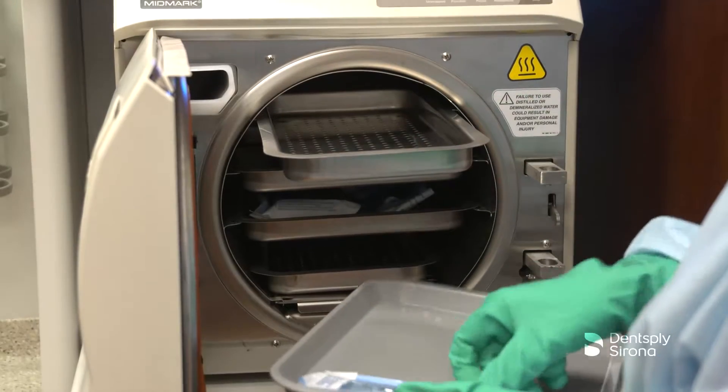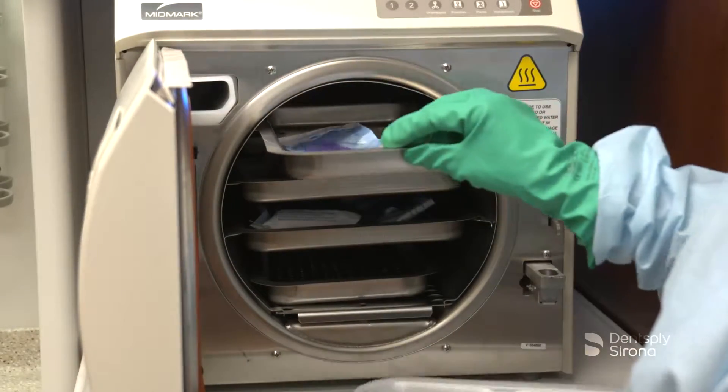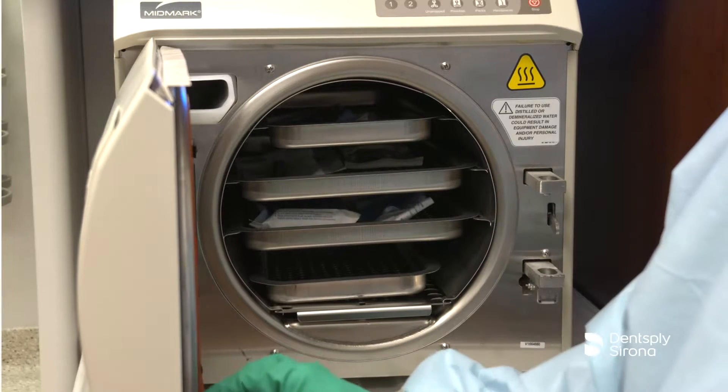Allow the dry cycle to complete prior to emptying the items from the autoclave. If items are still wet, allow them to dry completely before storing.